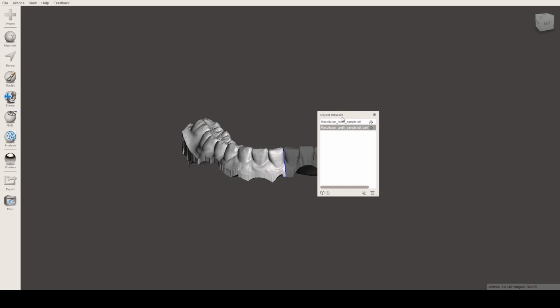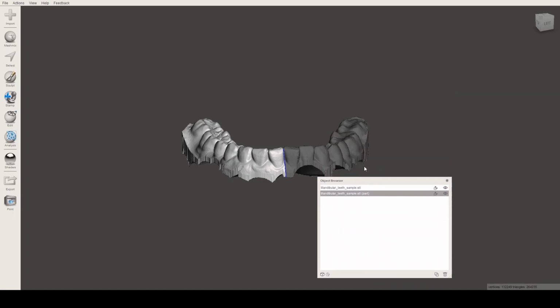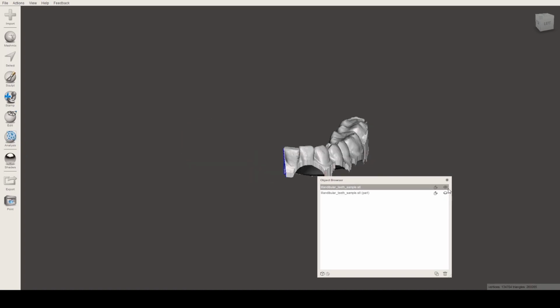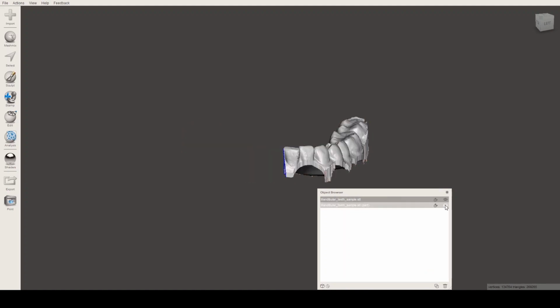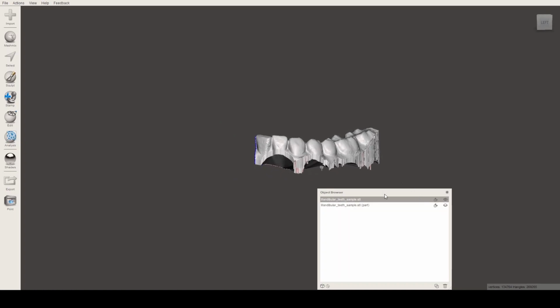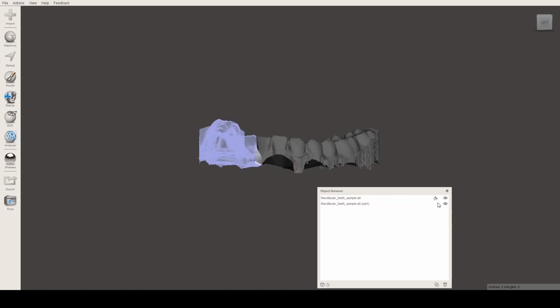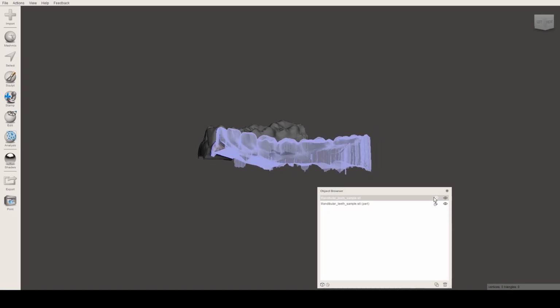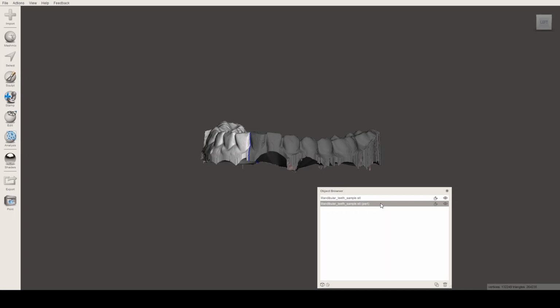And now we have here our object browser. As you can see, when we separated it, it is now two objects. If you want to just show the right part of the teeth, then you can click this. So this is the viewing, and this, I don't know what that magnet icon does. Let's actually click it. Oh, it doesn't do anything. Oh, it shows wireframes. The magnet button shows the wireframe of your model. So you can see there, the object that you select will be the one highlighted, and basically that's how you separate a model.